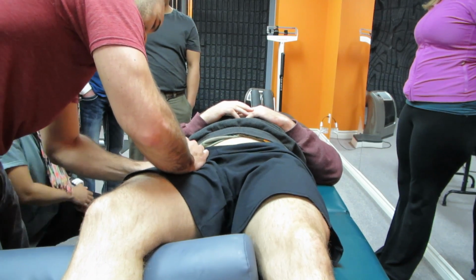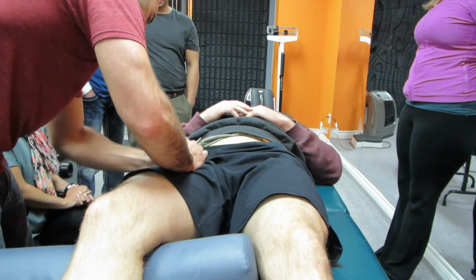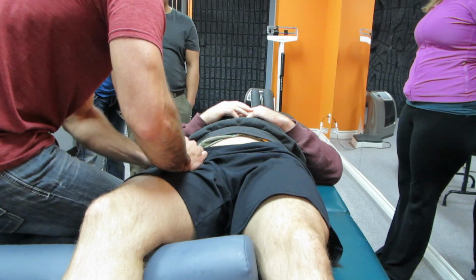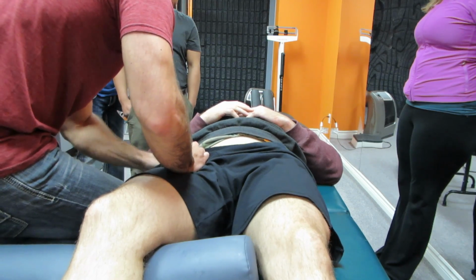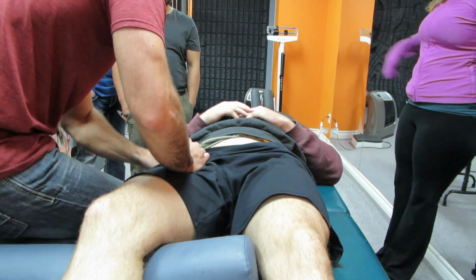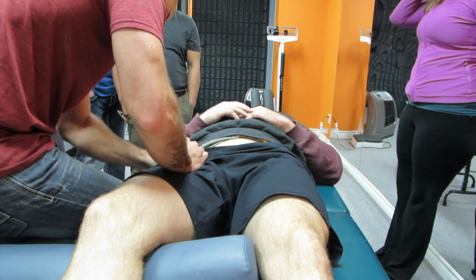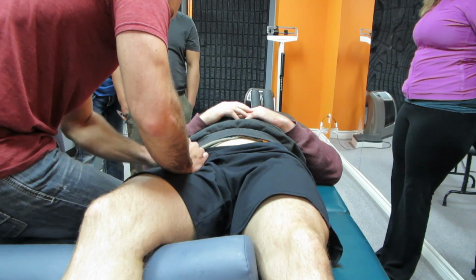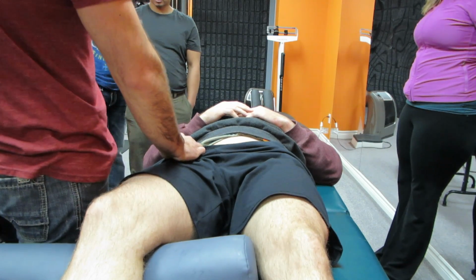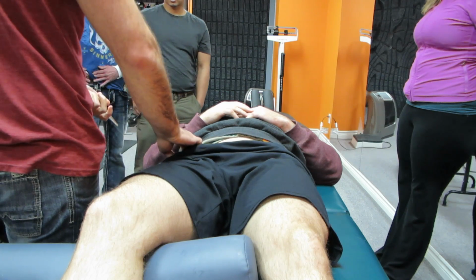No, he's saying it hurts. He's down. Feel it on himself. And like, there's not a whole lot of greenness in his, which is awesome. But try and go a little bit deeper with them. And that's kind of how we attack that rec fem, that attachment of psoas and everything like that.